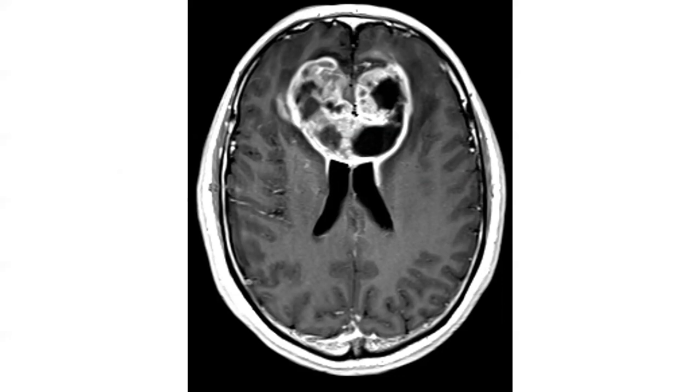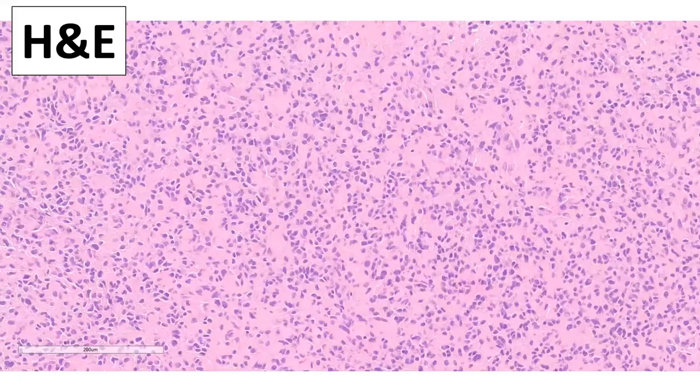No one wants to unmute. No one wants to talk. Are we still live? Does no one recognize butterfly glioblastoma? Maybe not. Lymphoma, primary CNS diffuse large B-cell lymphoma, can look like this, but it would be solid enhancement in the elderly population, not with all the central necrosis. So this is a butterfly glioblastoma.